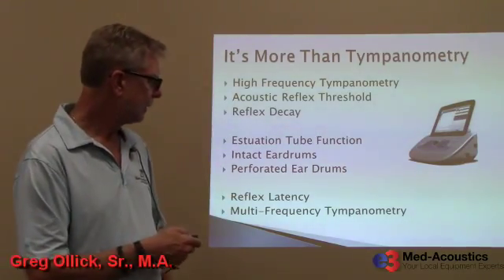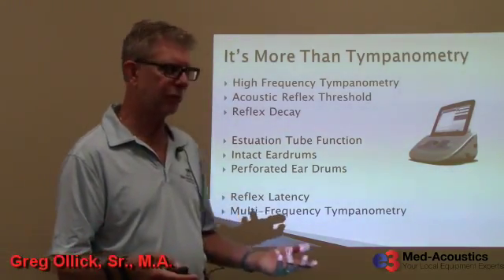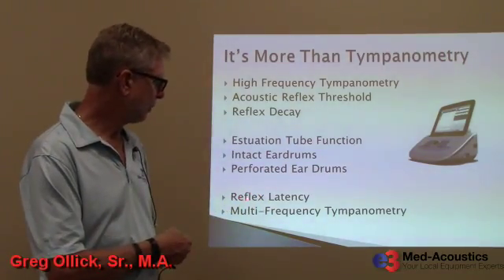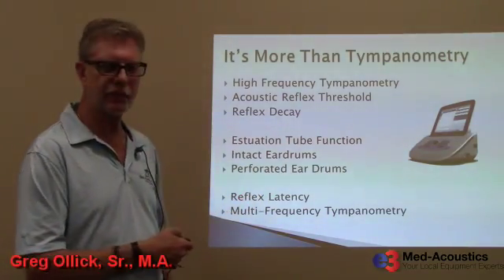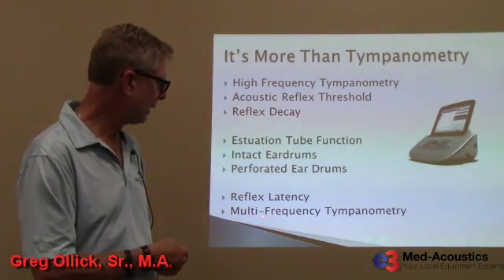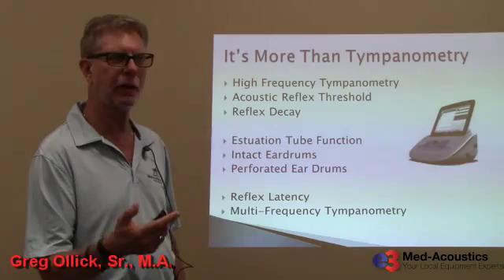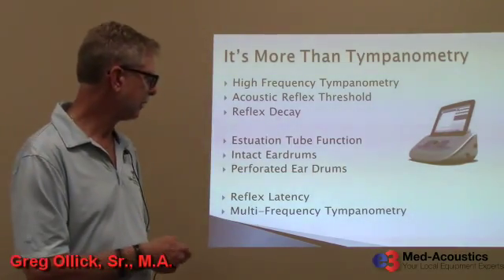Okay? Some other functions that you will find available on these middle ear analyzers are reflex latency, which we'll talk about, and high-frequency tympanometry. That would be used on newborn infants.